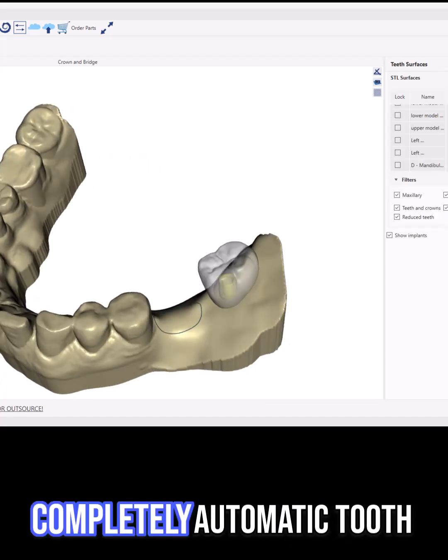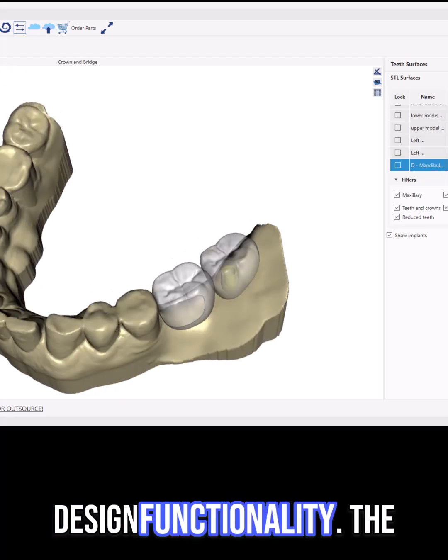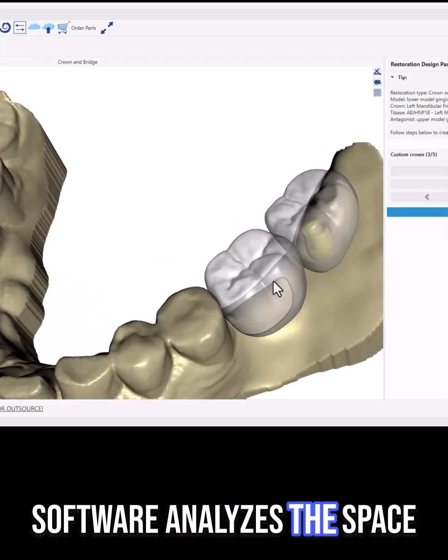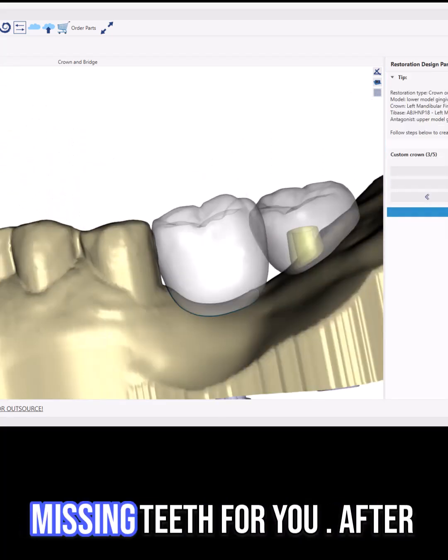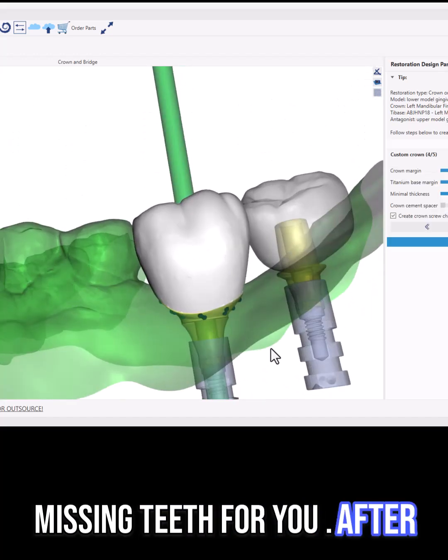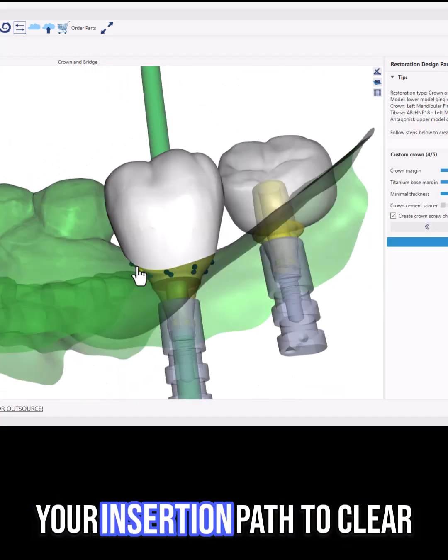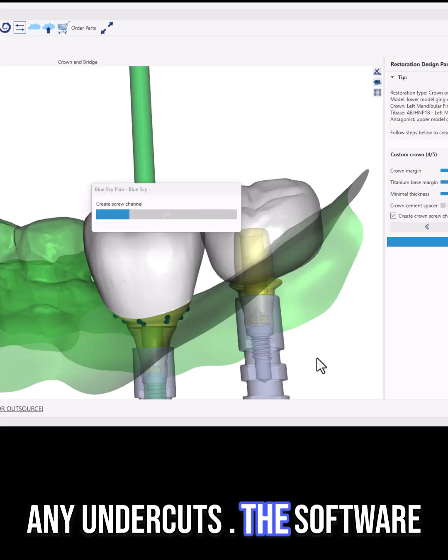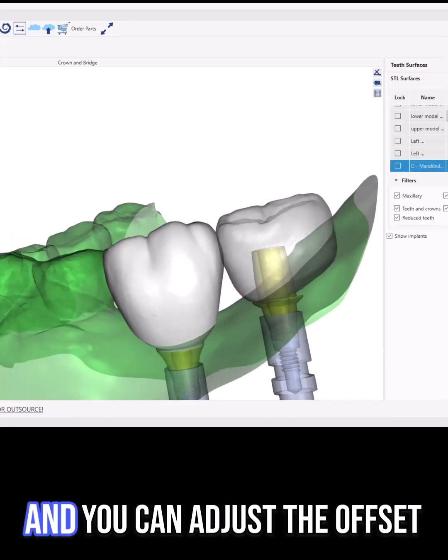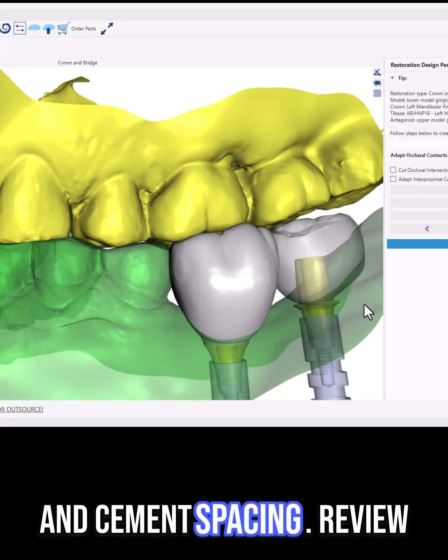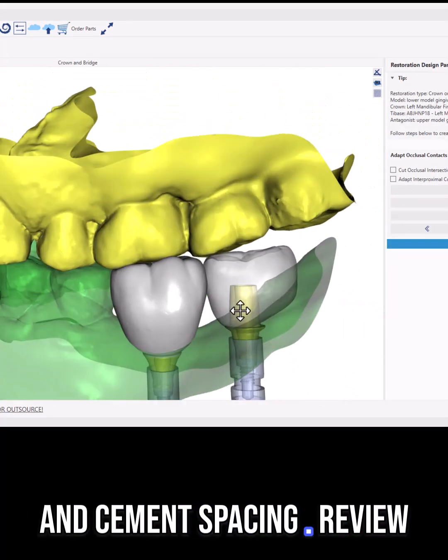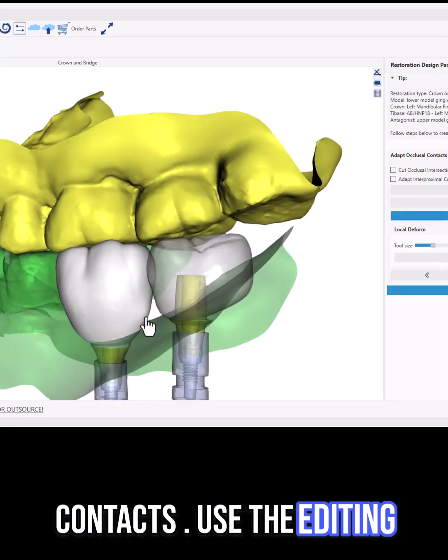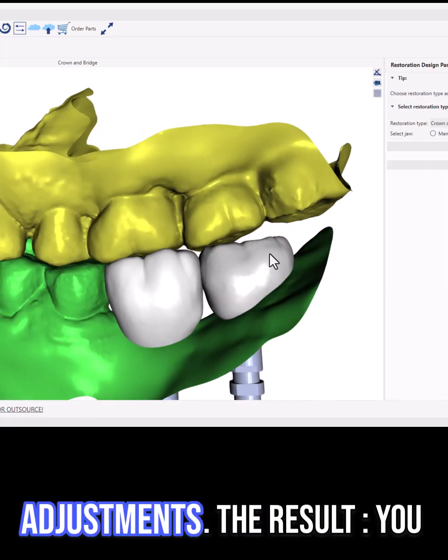Then use our completely automatic tooth design functionality. The software analyzes the space and automatically designs the missing teeth for you. After the teeth are created, set your insertion path to clear any undercuts. The software auto-suggests your margins and you can adjust the offset and cement spacing. Review the anatomy shape and contacts, and use the editing tools for any final adjustments.